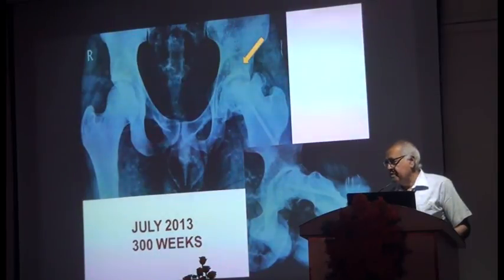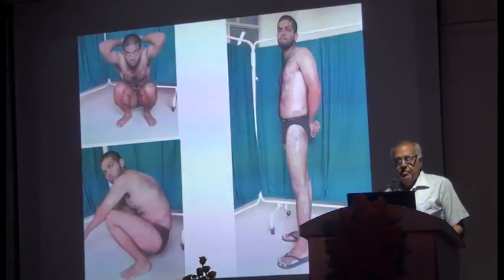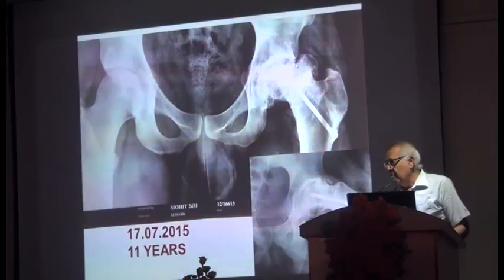The boy studies in St. Stephen's School, college. And here, if you now do a valgus osteotomy, it will work because there is impingement here. Abduction is limited in this patient. There is impingement, but there is full range of motion as far as flexion is concerned. So this is after 11 years, and I feel like doing a valgus osteotomy, which will positively work.